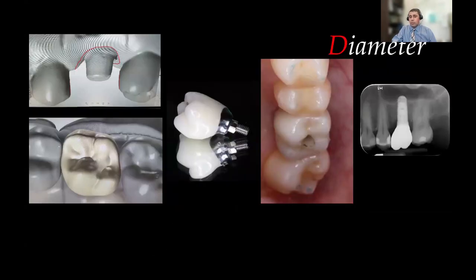And how does that transfer to practice? Is again using the widest implant in the posterior segment to support the tooth that you would like to have. And in the molar region, you would like something around, probably 5 to 6 millimeter of implants. That would be ideal in that case. Premolar area, you want something around the 4 to 4.5 millimeter range. And as you move to the anterior segment, that's when you start utilizing narrow implants. Use of narrow implants in the posterior segment generally is not preferred.